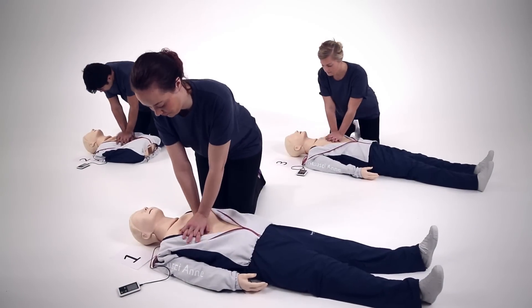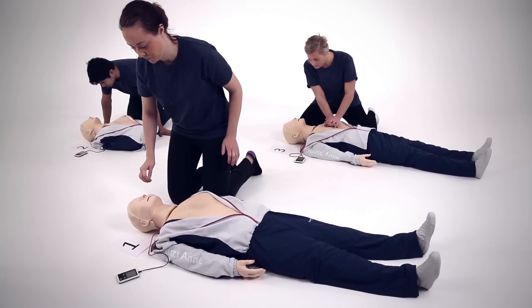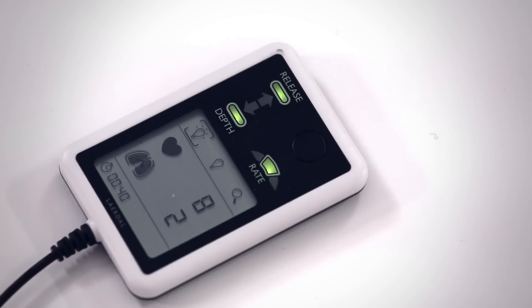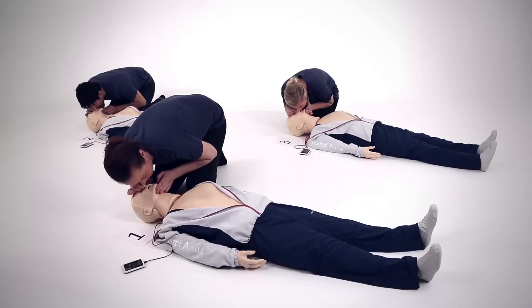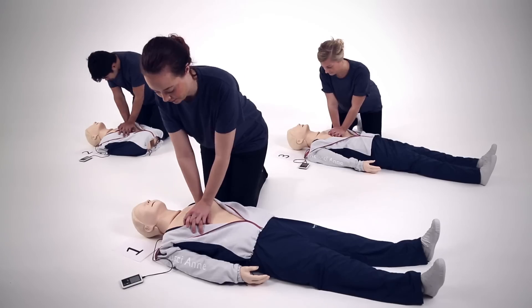For real-time individual feedback on CPR performance, Reisussian QCPR can be used with Skill Guide. This gives a student live feedback on CPR performed, as well as a summary and hints for how to improve.